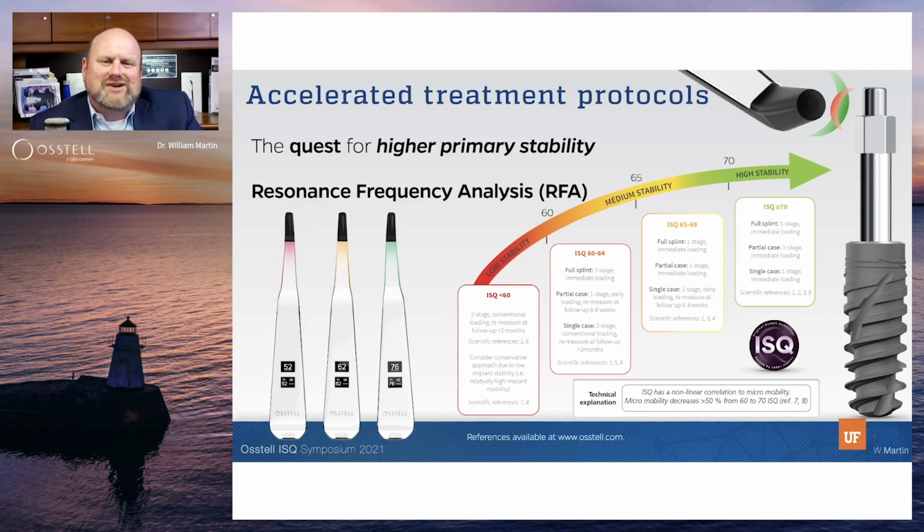need to have the actual number, because there's going to be a difference if an implant's at a 60 and it goes up to a 69 versus it's at a 60 and it drops down to a 58. These are things that we want to keep an eye on. So we just don't generalize these numbers. We actually want to record them as is.